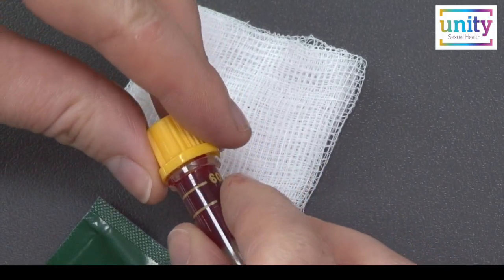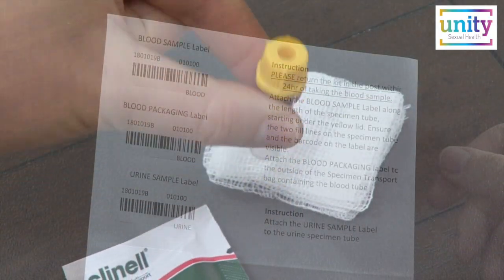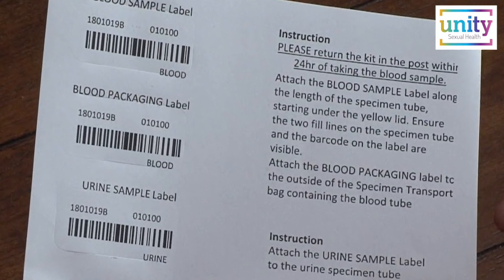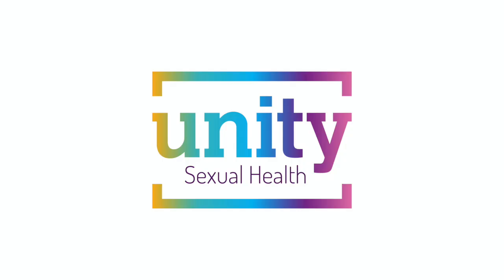Securely press the lid back onto the specimen tube, then carefully turn it upside down 5 times. Refer to the information sheet in your pack for details on how to return your samples as quickly as possible. Thank you for using Unity Sexual Health Postal Kits.